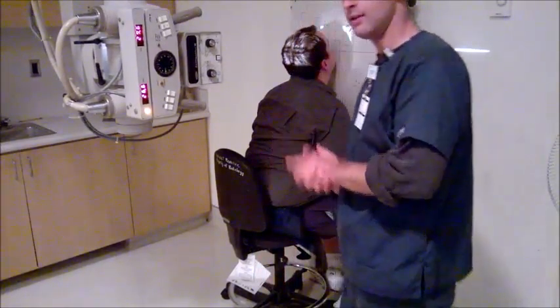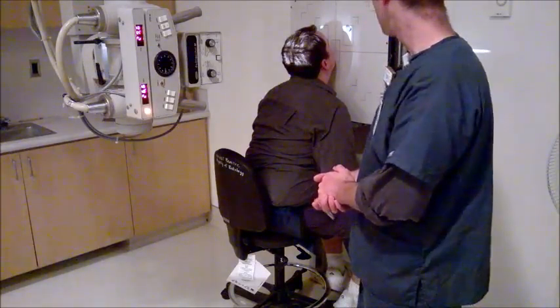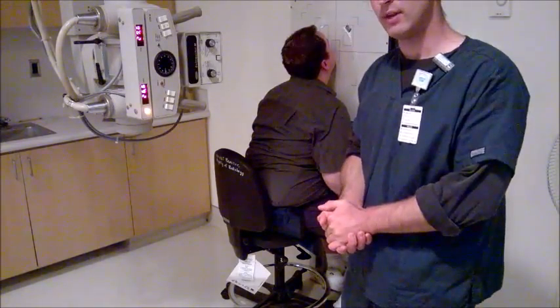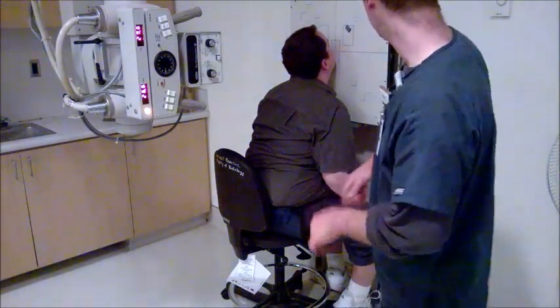Alright, since it's diagonal, it's an axial, so I would go up on my technique a little bit, 70 kVp at 25 mAs. And I would take this exposure.